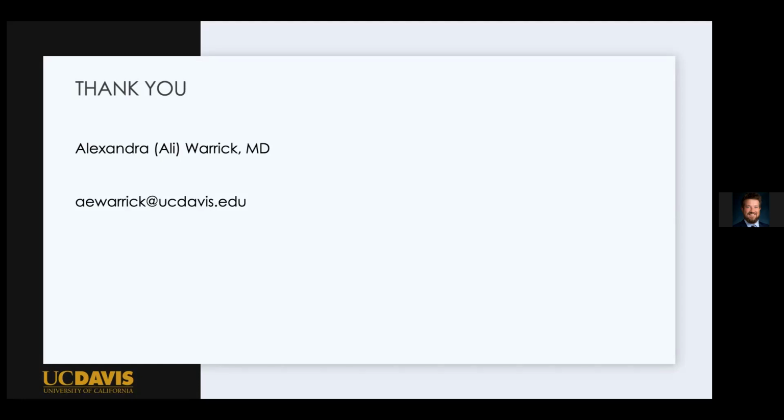The other point, I guess two other points, is regarding the FCL. Patient positioning for this is critical. If you don't have the patient in a decent amount of varus stress, that FCL is going to be rather lax and wavy, and evaluation can be a little challenging. So I always bolster their knee to put them in a decent amount of varus to help me with scanning.